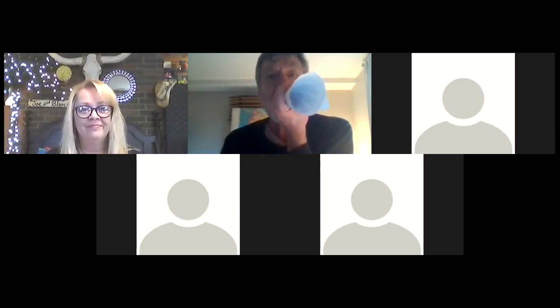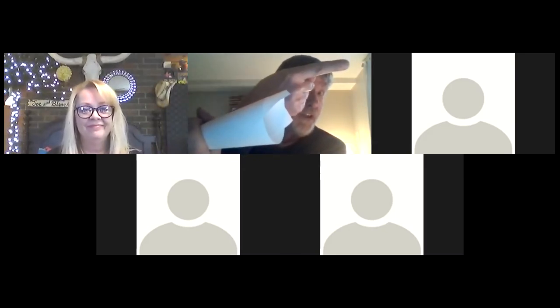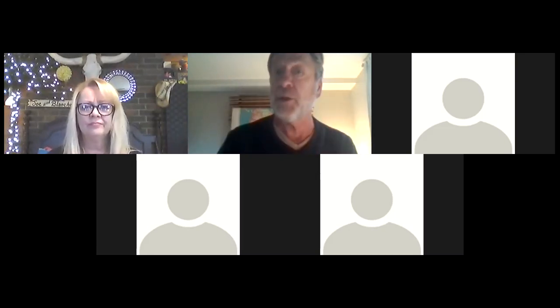So if you want to imitate to someone how elderly people hear, talk backward into a backward horn. That's how elderly people hear, because they can't hear the highs. Okay? So what hearing aids, of course, want to do is to take that sound and turn it upside down. But anyway, if you're talking this way into a horn, you're increasing the highs. If you're talking this way, you decrease the highs. And that's why I mentioned to you about old tubing in BTEs. If it gets narrow, you're doing a real disservice. Yank out that dang tubing and replace it.